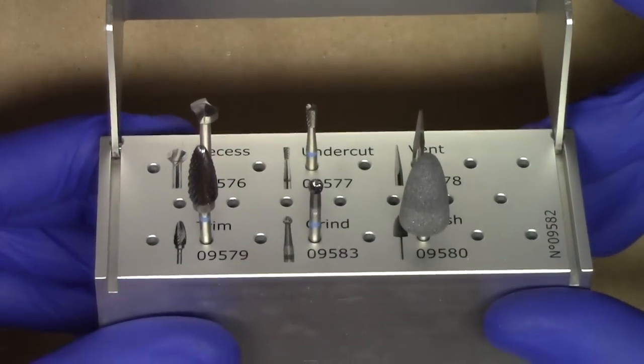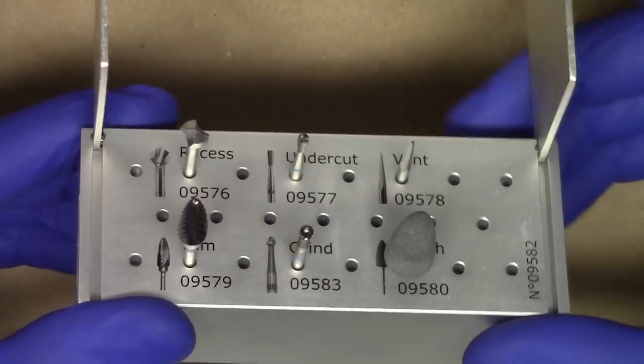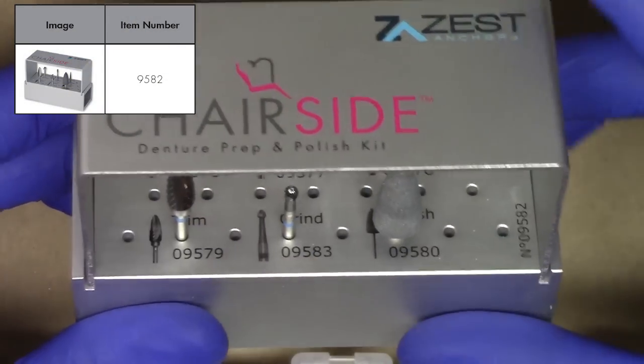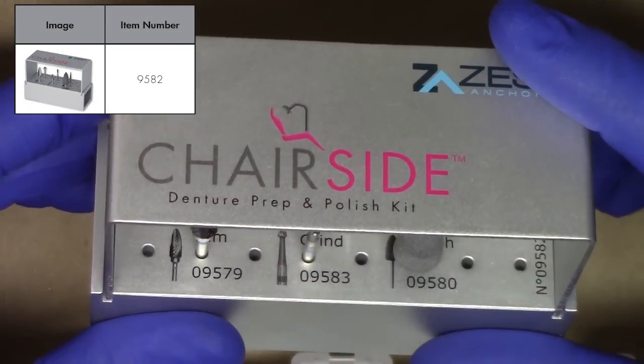All of these burrs can be purchased individually, but Zest has gone ahead and provided a unique kit design with everything all in one, so that way it really facilitates your procedure.